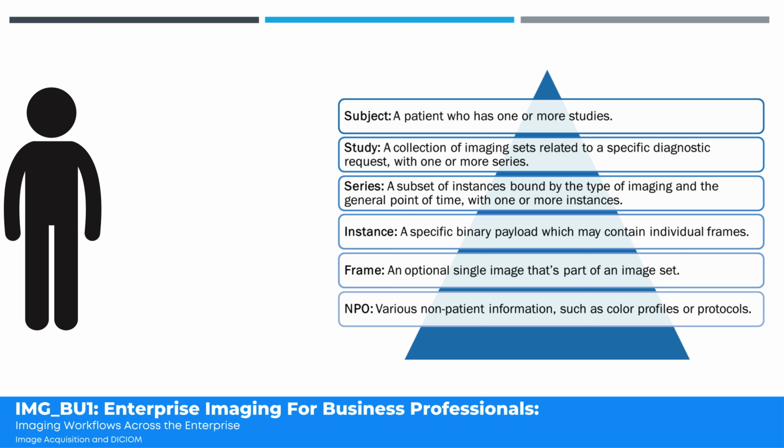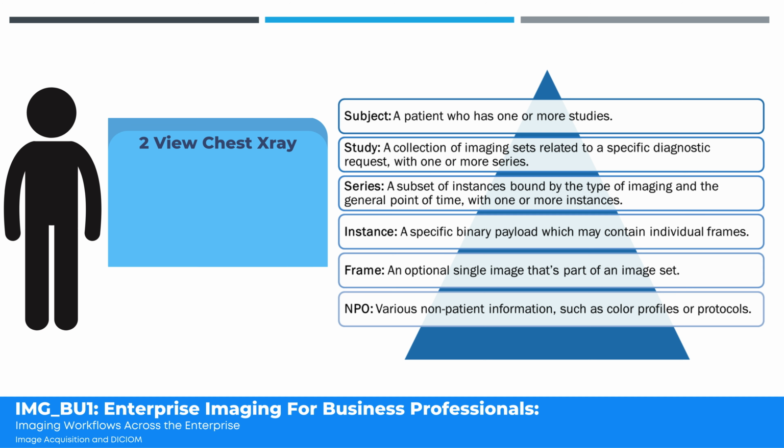At the top of this hierarchy, we have the subject, which is the patient that is receiving the imaging. This patient is going to have at least one study, one or more imaging studies associated with them. The study itself, if we zoomed in on that, is a collection of imaging sets that are related to a specific diagnostic request that was ordered. That study is going to have at least one series, one or more series.